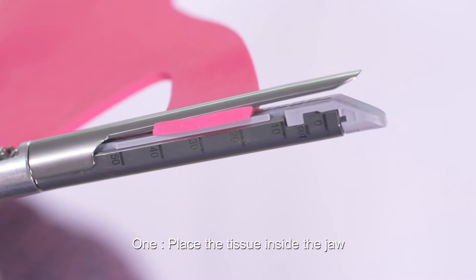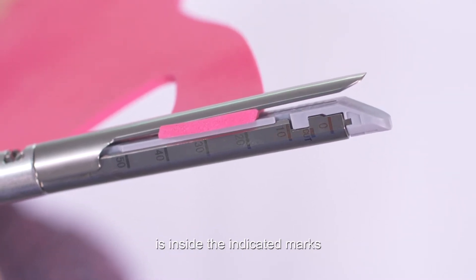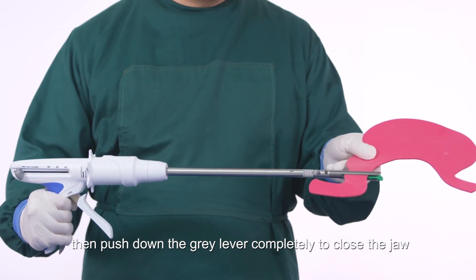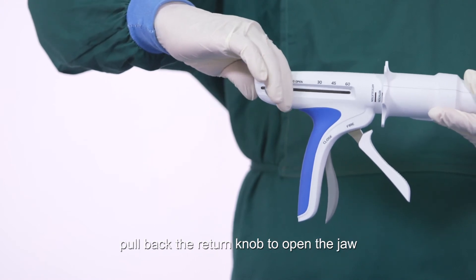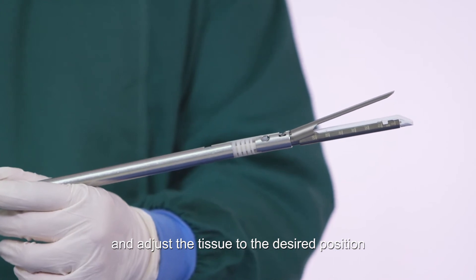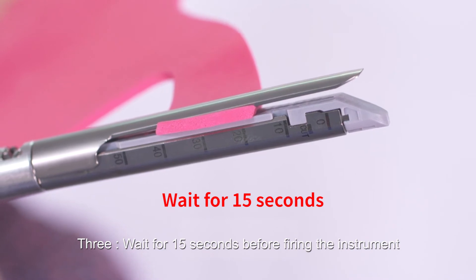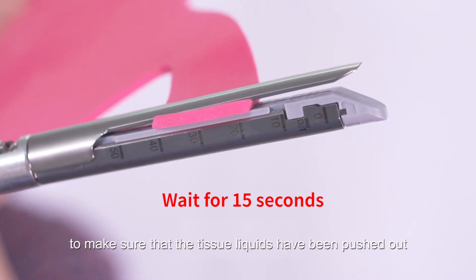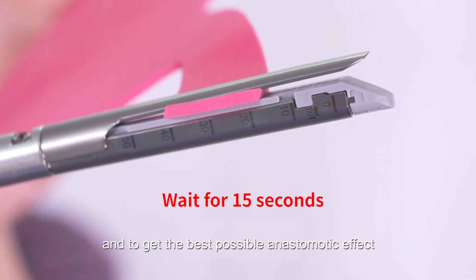Positioning tissue, cutting, and stapling: place the tissue inside the jaw, making sure that the tissue to be operated on is inside the indicated marks, then push down the gray lever completely to close the jaw. If the tissue needs to be repositioned, pull back the return knob to open the jaw and adjust. Wait 15 seconds before firing to ensure tissue liquids have been pushed out for the best anastomotic effect.